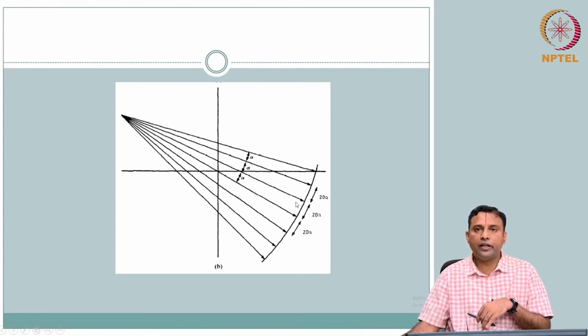So if we take this configuration, is this sufficient for us to describe the geometry? Well, no. What do you have? You have a source, you have an object, you have a detector. So we have to have a reference frame so that you have a field of view where the object is placed in relation to the data acquisition. One side is your source, the other side is your detector. So we will take the ISO center in this configuration, that is where the patient is. So that is your object near the ISO center. On one side you have your source, the other side you have your detector.